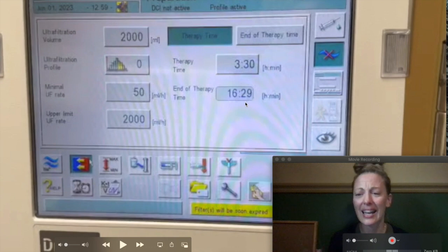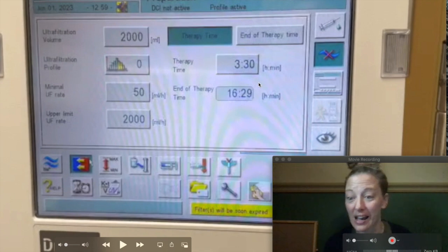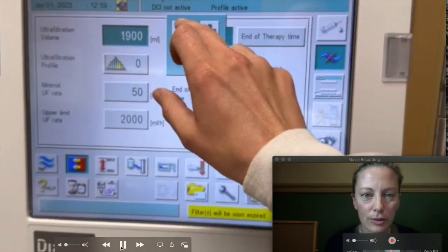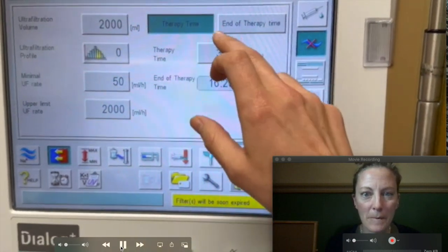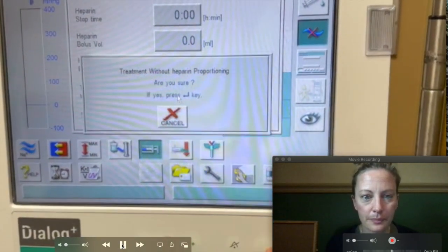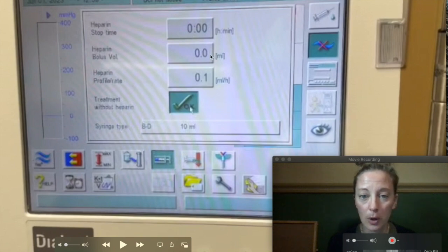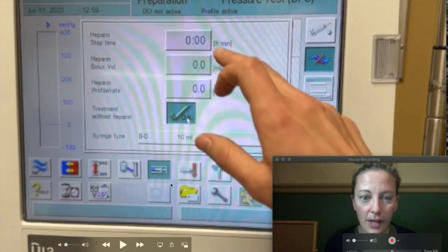Sometimes patients will say 'Lindsay, I need to be done by 4:15 — can you cut it? I'll sign an AMA form, I have a hot dinner date, I've got something going on.' So then I can change the therapy time here. That's me changing the fluid goal — I can go up and down, or key it in manually. I can change the time the same way, going up and down or putting it in manually. Now they're going to be done about 1700, about five o'clock. Now this one right here is heparin. Heparin stop time — what bolus I'm going to give them, their initial heparin dose, and then if they have a profile rate. I'm going to key that in and verify that it is correct. And if this is pushed in, I'm doing treatment without heparin, because not everybody gets heparin.